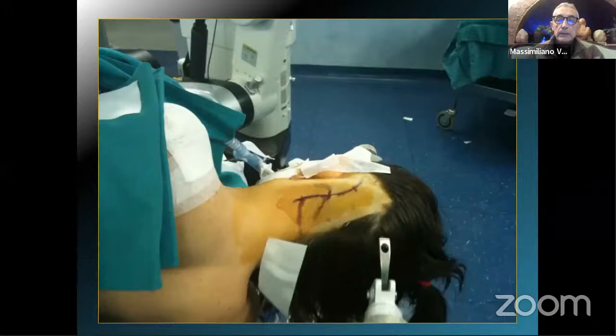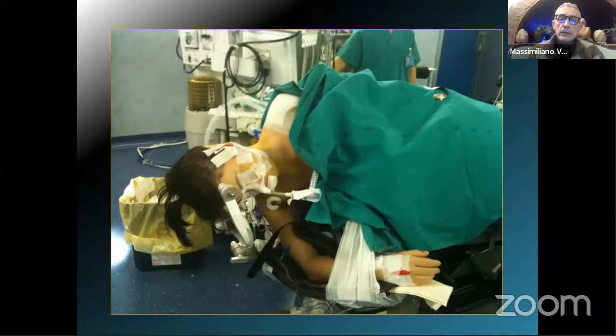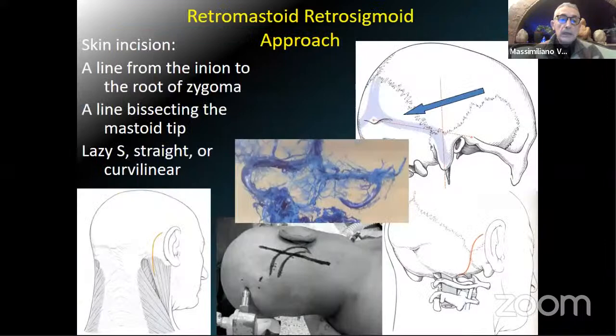And as we see here, this is the surgical operating theater, and also the target point, the surgical key point, according to Tatagiba's presentation, who called it the asterional approach, the pterional approach of the posterior cranial fossa, a very interesting and clever definition of this simple but delicate surgical approach. We can identify the angle where to put the drill between the posterior root of the zygomatic arch, which is an ideal prolongation of the transverse sinus, and the vertical line on the tip of the mastoid.